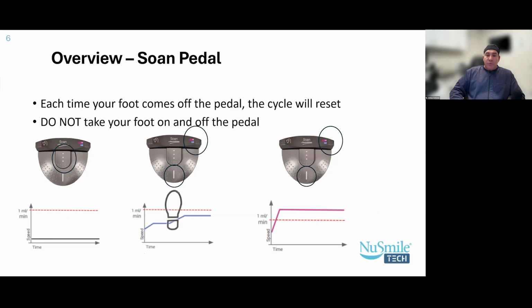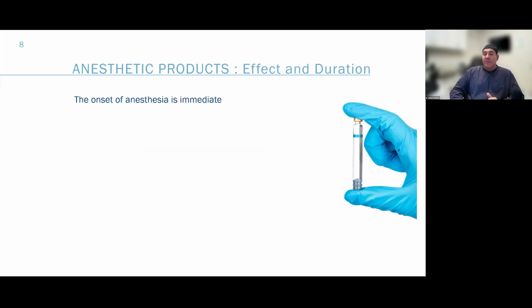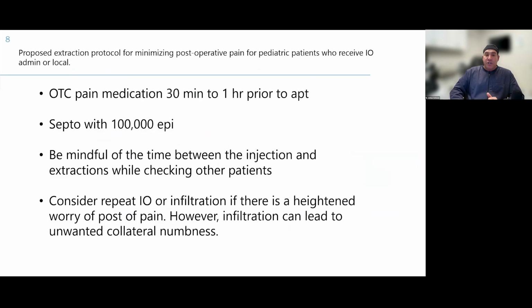I want to move forward here just for a second. We talked about the pedal. If it's not responding, just move your pedal to the side a little bit. It's likely just because it's getting some radio interference there with your chair.